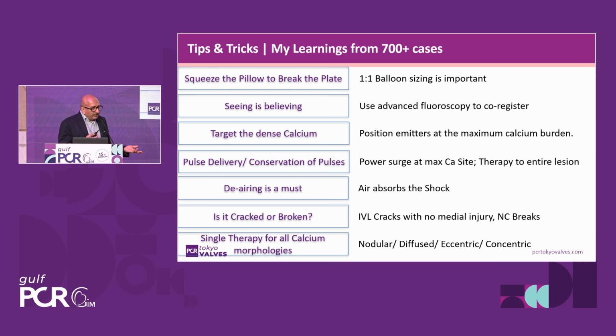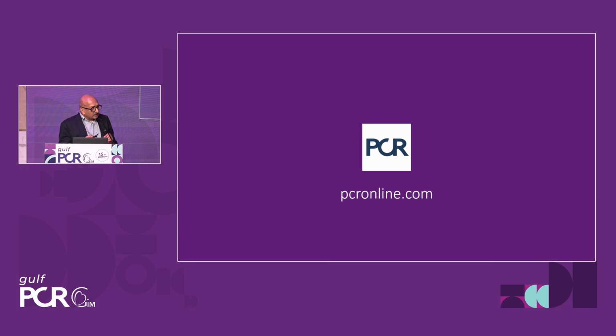And then de-airing is a must, because air absorbs the shock and may not give it properly. And of course, IVL cracks with no medial injury is the key to success. And single therapy for all calcium morphologies is the thing which we have learned and noticed now. Nodular, diffuse, eccentric, and concentric, everything can be done. So with this, I'll stop here. Thank you very much.